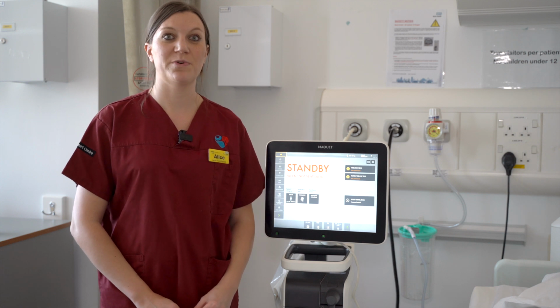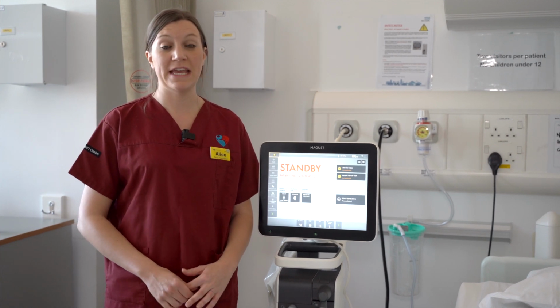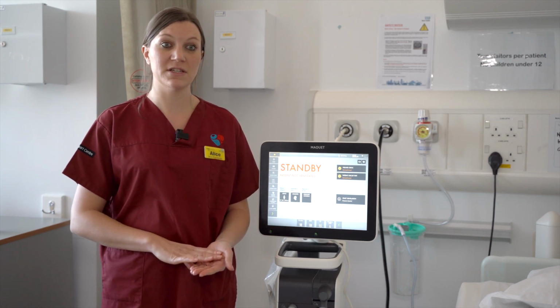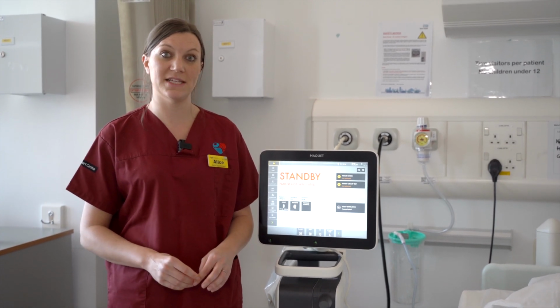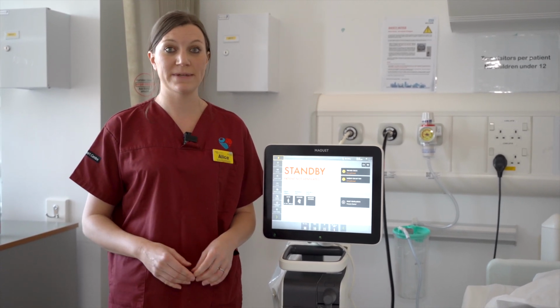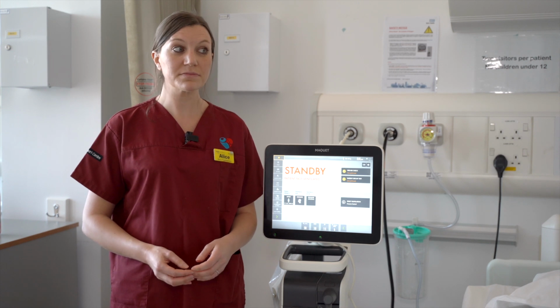We just want to touch upon some common problems that may occur. One of the things is the movement or dislodging of the endotracheal tube. It should always be checked at the length at the patient, and also make sure that this is corresponding and the same as what is documented on the ICU chart. Make sure that after any significant moving or rolling and repositioning that the tube remains at the same length as documented and was previous to the move.